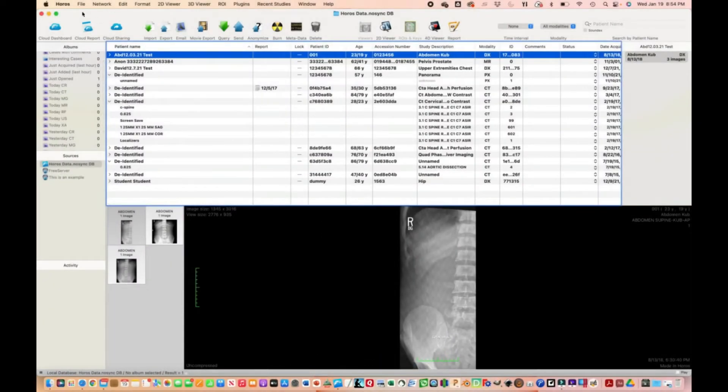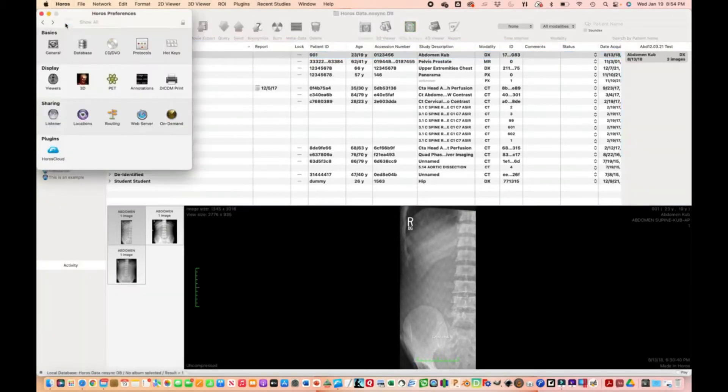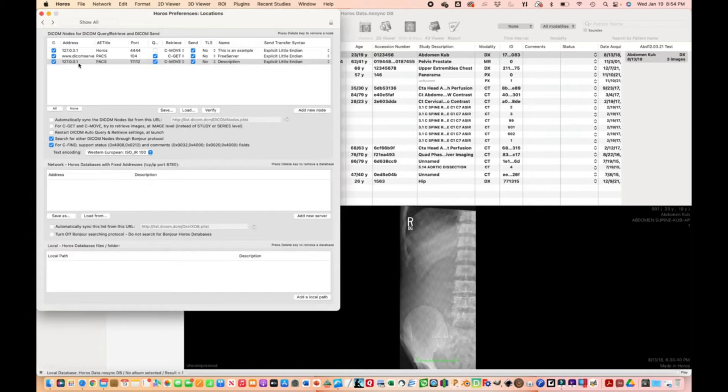This is how to configure Horos. Go to the Horos menu, preferences, then locations. Click 'add new node' and I'll show you how to configure it for our free server.